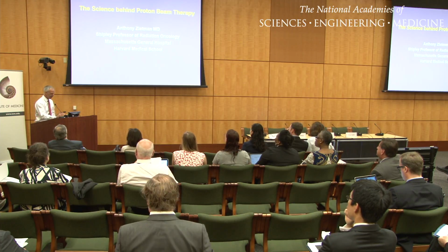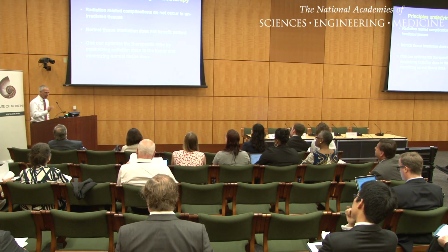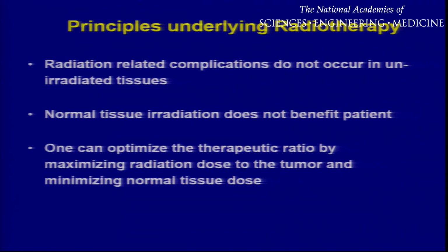My charge today is to give you the science behind proton beam therapy. I'll just emphasize what Steve Shimura has told you. There are certain principles that underlie radiotherapy that really feed into our thinking. Radiation-related complications do not occur in unirradiated tissues. That's a core principle. And normal tissue irradiation, even if it doesn't cause a complication, cannot benefit a patient, so it is to be minimized. One can optimize the therapeutic ratio by maximizing the radiation dose to the tumor in order to increase cure rates, and minimizing normal tissue dose to minimize complication rates. That's it. That's the principle of radiotherapy.